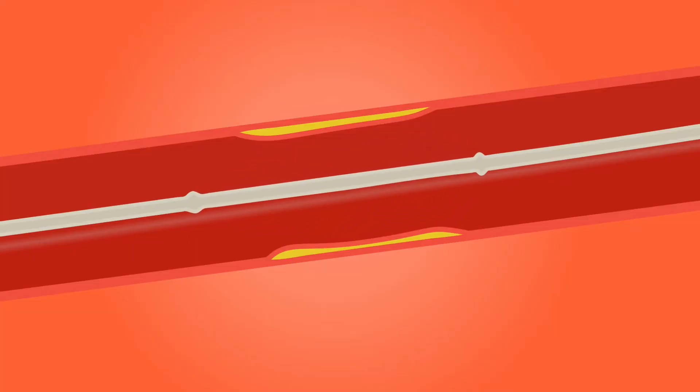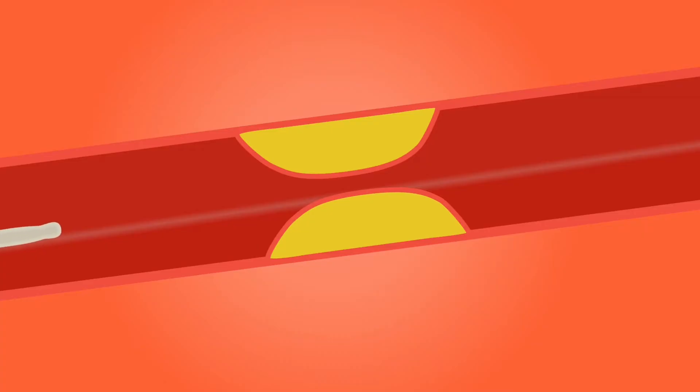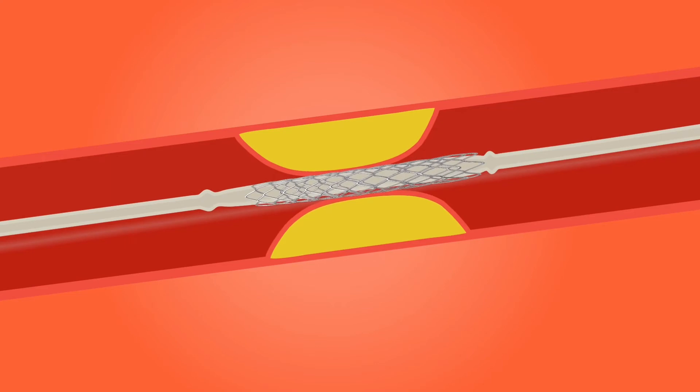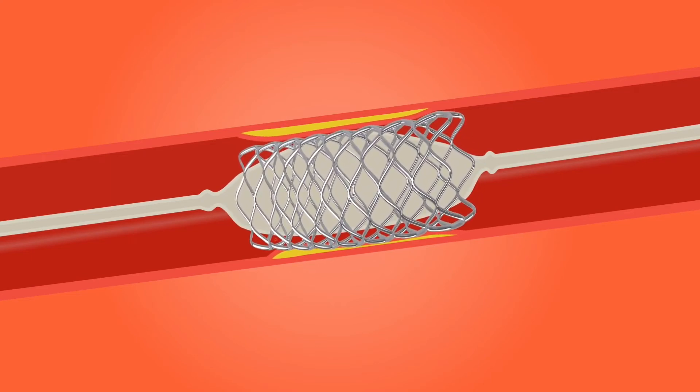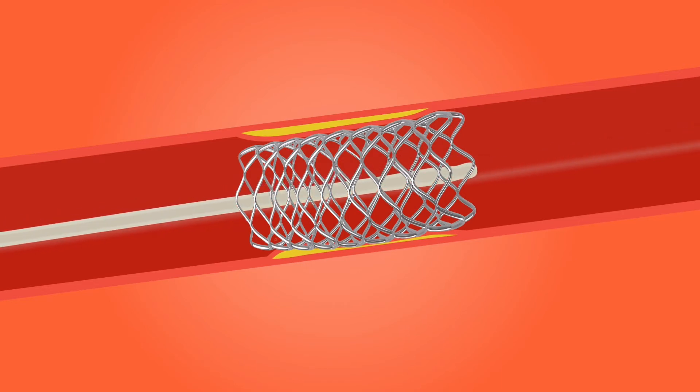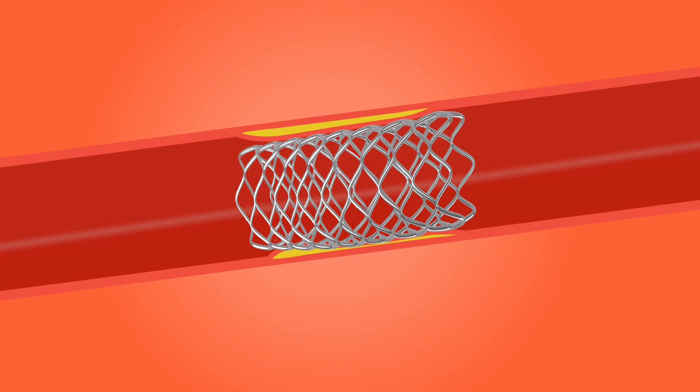Once the pathway is clear, the doctor removes the balloon from the body. Then a second balloon — this time carrying a stent over it — is sent to the blocked area. When this balloon is inflated, the stent also expands and presses against the artery walls, fixing itself in place. The doctor then removes the balloon, wire, and catheter from the body. With the stent in place, blood can now flow easily through that part of the vein or artery.